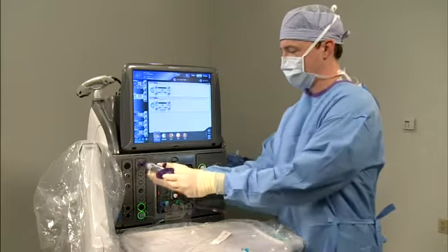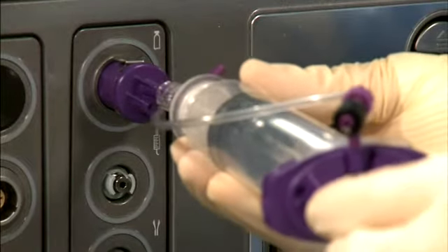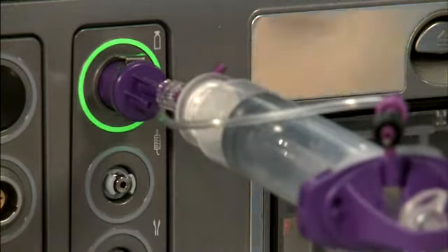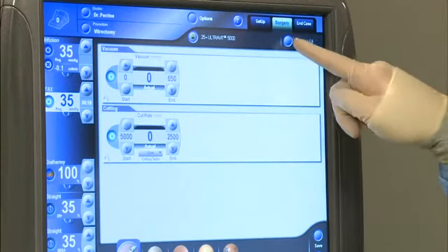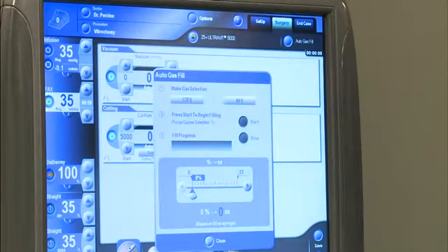The auto gas fill is equipped with radio frequency identification. Upon connection to the console, the ring around the port will illuminate green. Press the button labeled Auto Gas Fill in the upper right corner of the display screen. The Auto Gas Fill control screen will pop up.